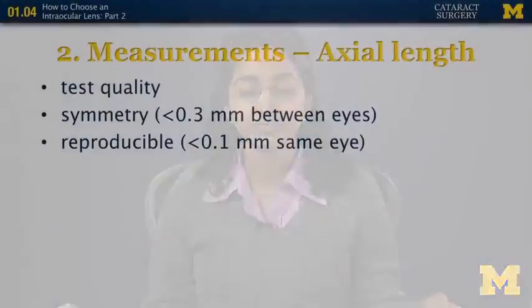Is it due to poor technique on the operator's part or poor fixation on the patient's part? And finally, if those aren't the factors, is there some other anatomic explanation, such as a scleral buckle, staphyloma, or perhaps just an anatomic variation, in which case we can even check the manifest refraction to see if it follows with a more myopic refraction and a longer eye.